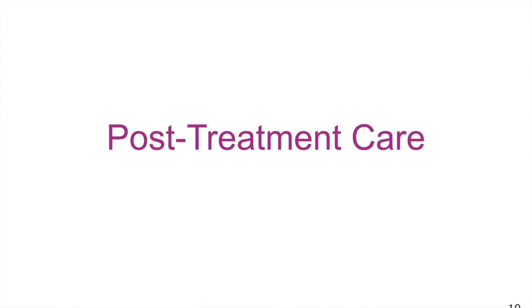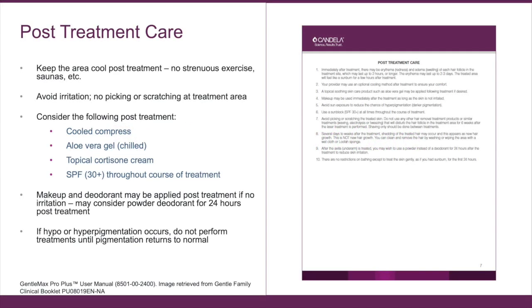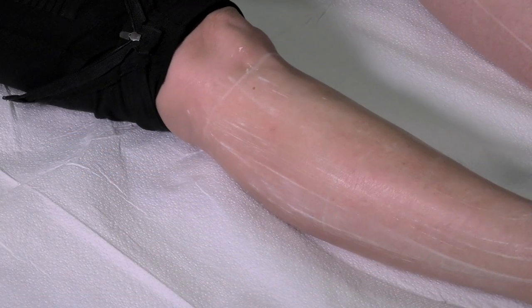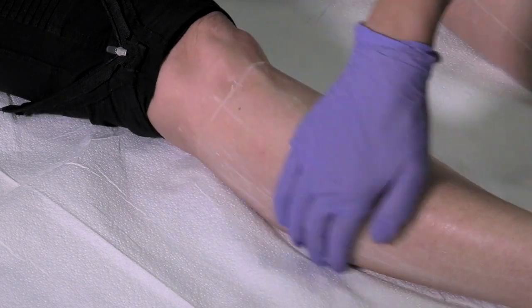Once the treatment is complete, apply cool compresses to the treatment area. Topical cortisone may be considered at physician's discretion. Sunscreen should be applied to the treatment areas that will be exposed to the sun. Review pre- and post-care instructions with the patient.